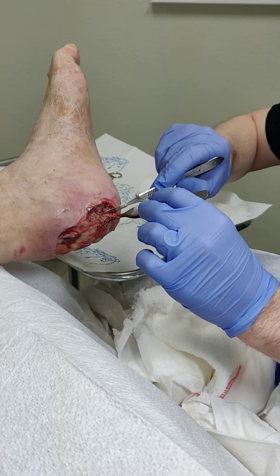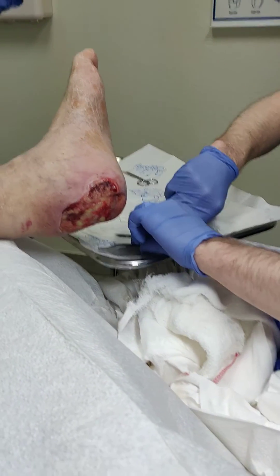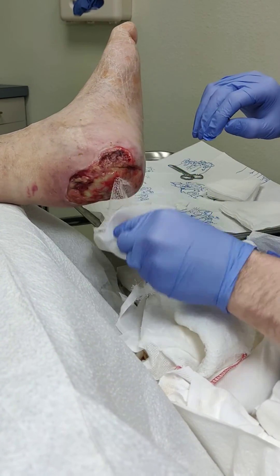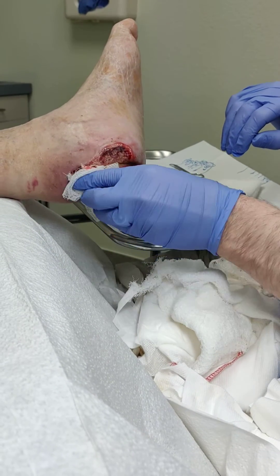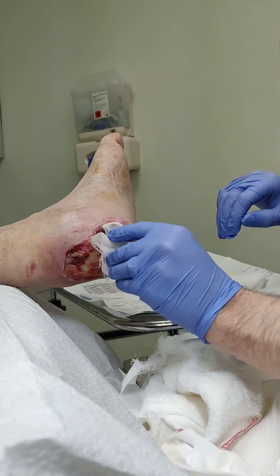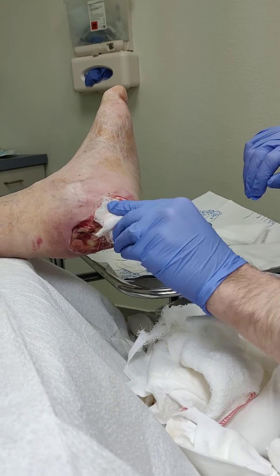Our patient has been coming along very well. The white stuff and the black and brown stuff we want to get rid of, but this kind of red beefy stuff is exactly what we're looking for — that's granulation tissue. That's the first thing the body lays down; it's a network of capillary beds that allow the fibrous mesh that will eventually become the scaffolding for skin to grow.